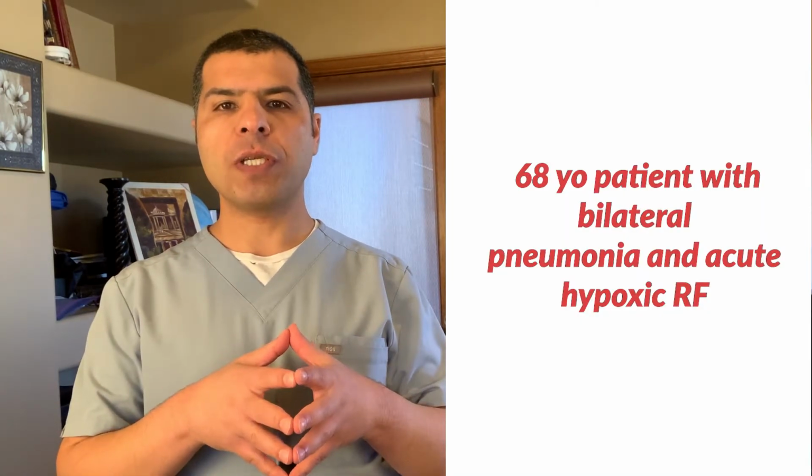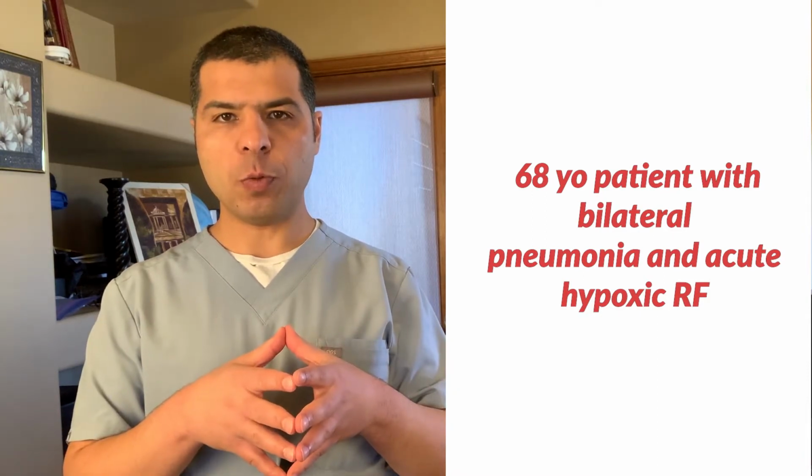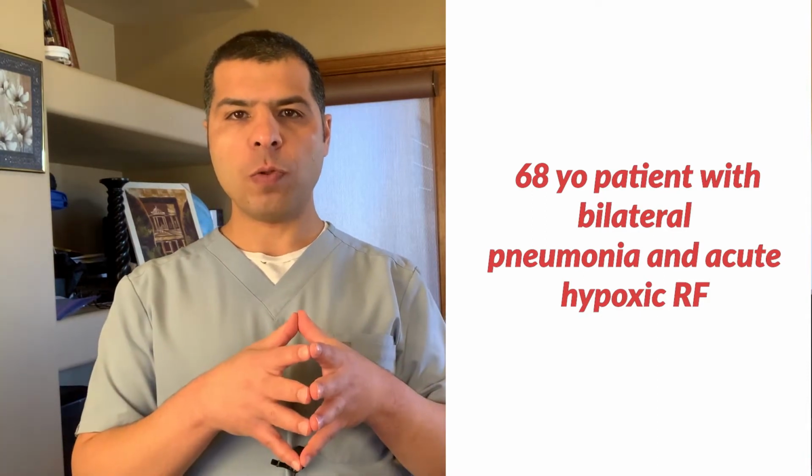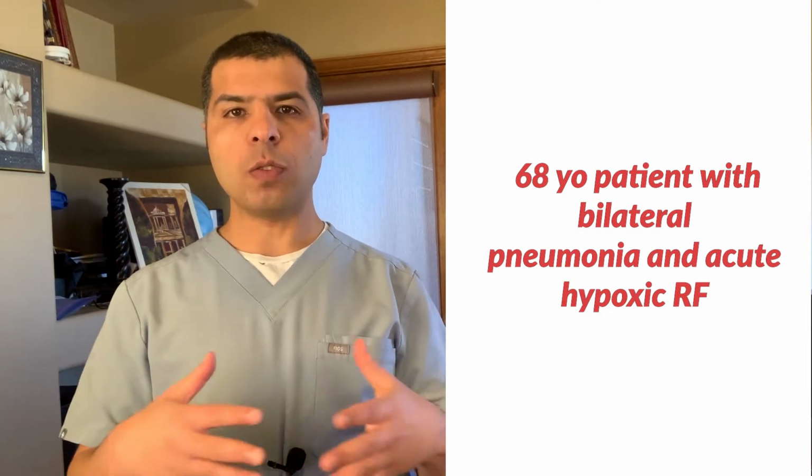I'm going to give you a real clinical scenario that needed to be intubated and the steps we made to intubate that patient. A 68-year-old gentleman with severe bilateral pneumonia and acute hypoxic respiratory failure. This patient was on the floor. Initially, he was DNR/DNI, do not resuscitate, do not intubate.